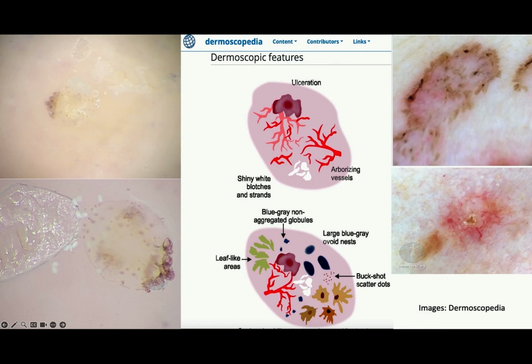So on the top, you just see a little delta wing-like structure. That's the thorax of the mite. And on the bottom one, you can see that clearly, and behind it is the track. And those little white dots that you can see are actually the eggs that the scabies mite has. I've diagnosed this, I've seen this with my dermatoscope, which is very cool.